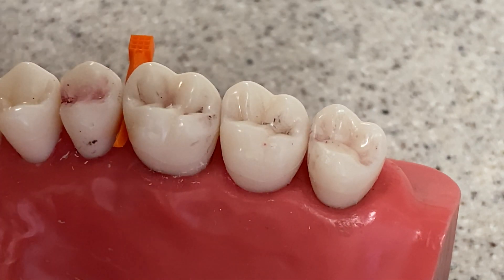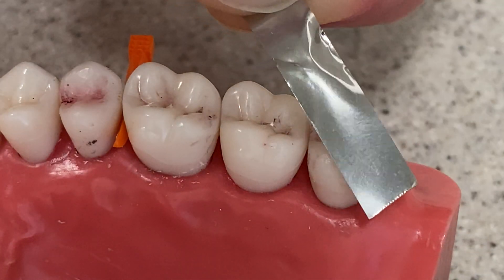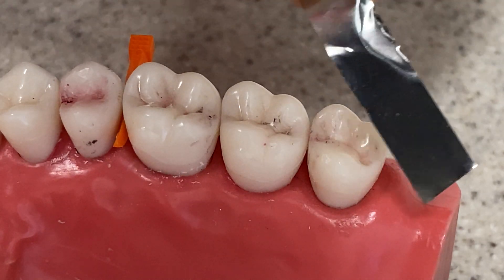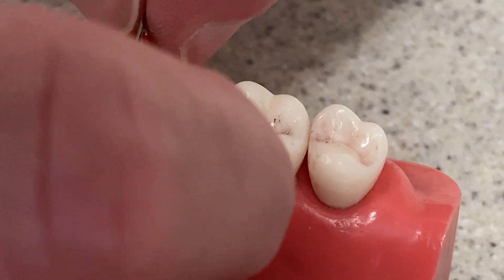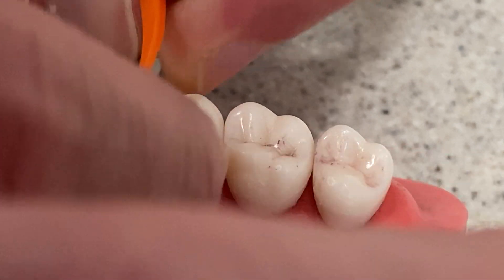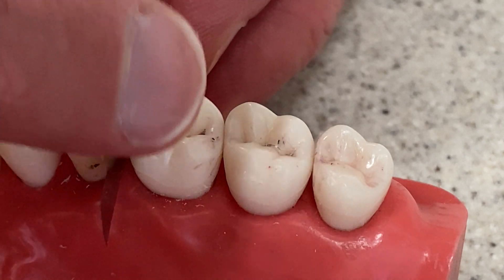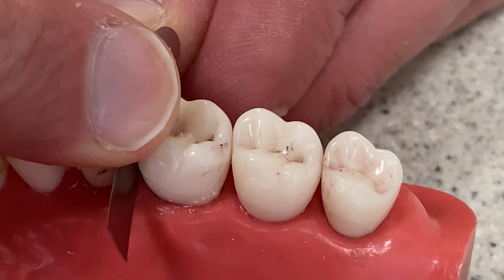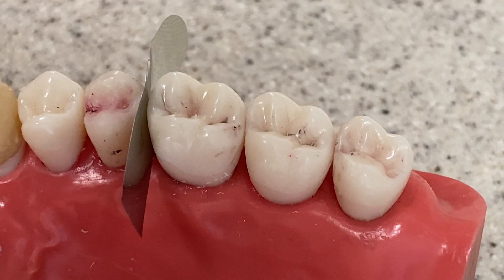Then you want to use a Toffelmeyer band — one of these Toffelmeyer bands that's been cut. You want to be careful because these are sharp, as you can see. So what you do is you slide it in partway, and it'll go partway because the wedge has actually separated the two plastic teeth, and then you can slide it through. After that, after you remove the wedge in order to get the strip in, you want to reapply the wedge. Once you do that, again all very carefully, because it's sharp. You've separated, and now you can go ahead and begin to do your procedure.